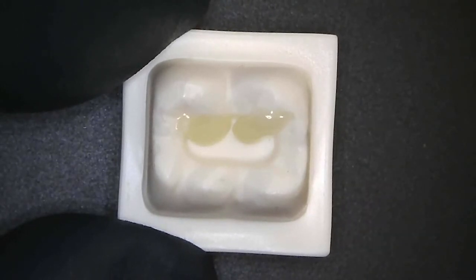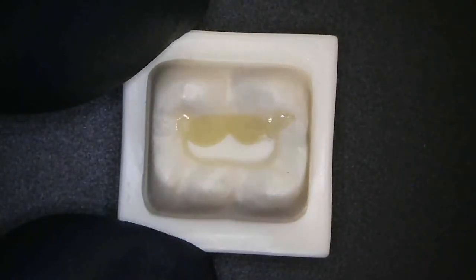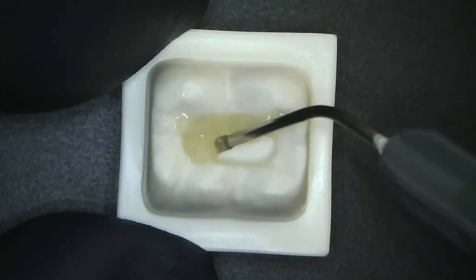At this point, I cure for 20 seconds — just a few seconds here for demonstration purposes — and then restore the other side, building up the cusps in the same fashion.